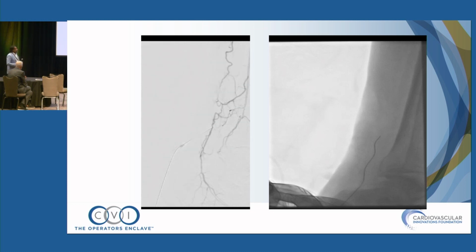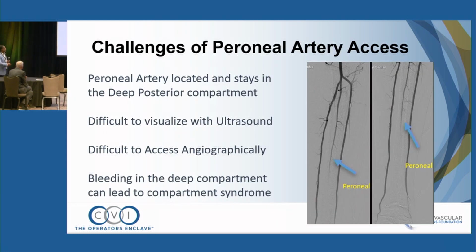So the first thing I do is get my access. I'll put in my non-hydrophilic wire that comes with it, make sure it's moving freely, and then I check it under fluoro, because I want to make sure it's moving freely under fluoroscopy.